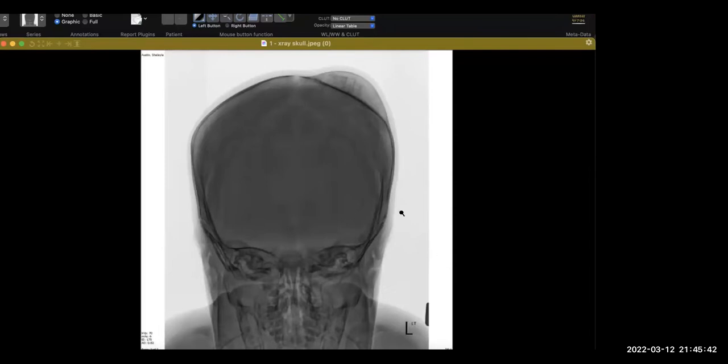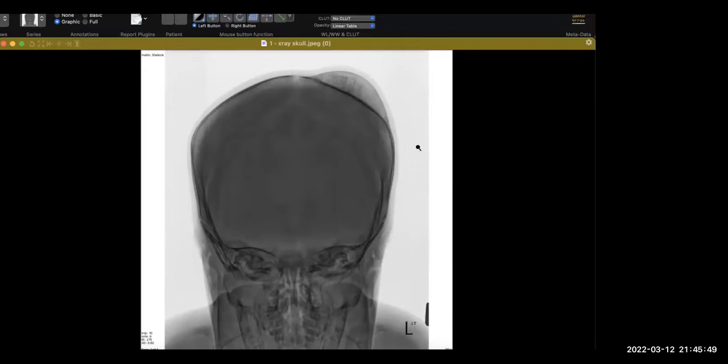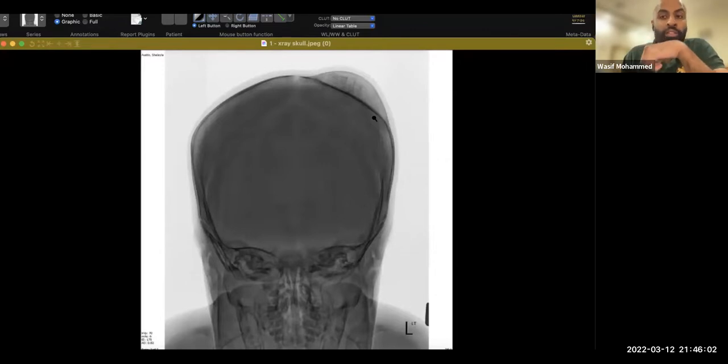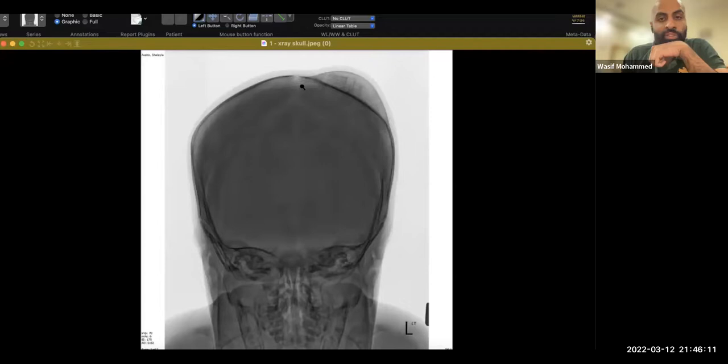So a cephalohematoma is outlined by the periosteum. It is limited by the periosteum. It does not cross suture lines. Okay. Subgaleal hematoma is between the galea aponeurotica and the periosteum. Finally, the last differential would be something between the skin itself and the galea, which is caput succedaneum. Okay. Caput succedaneum would have no problem traversing the suture lines, and it will be much more diffuse.